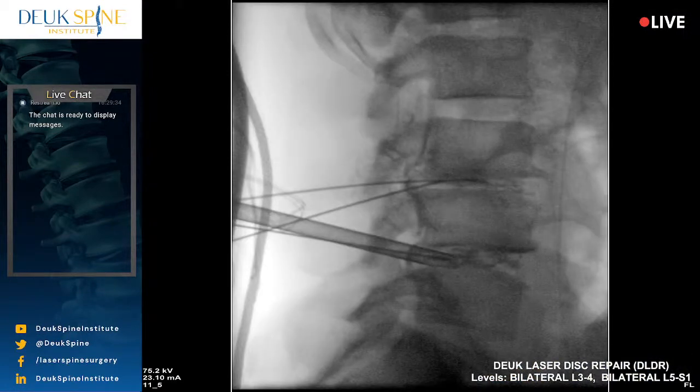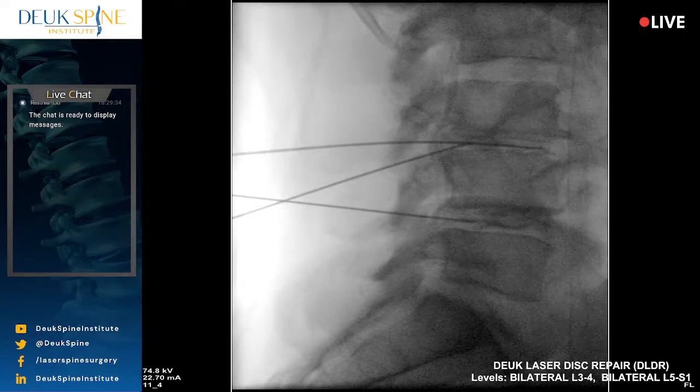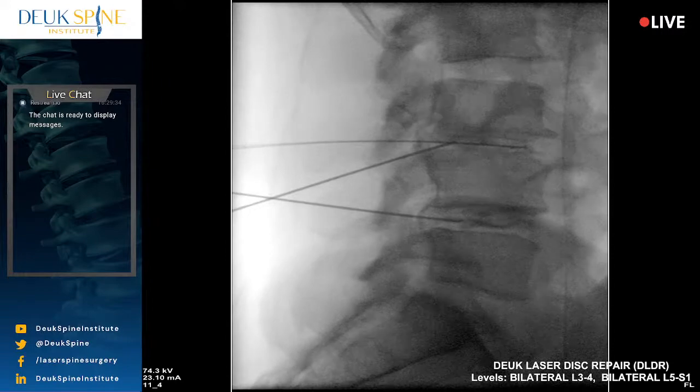You can go to a lateral view, please. All right, Luis, pressure here, and then I'm going to put the guide wire. Blood pressure is good. Needle is down. And let's get a shot. Good. Shot. All right, perfect. Guide wire's in place. Relax, Luis. I need to get this out. I'm removing this needle. I'm leaving the guide wire. Remember, we already made an incision, right? And I'm just going to go through exactly the same incision as I did before.